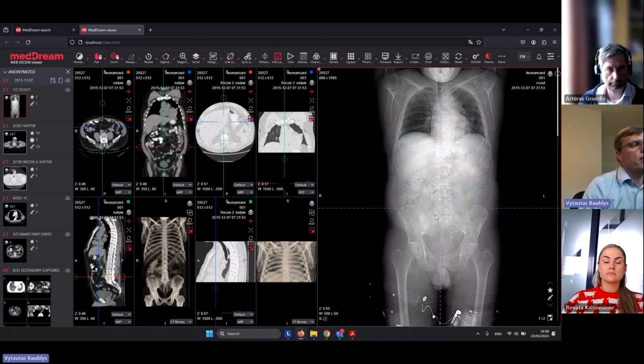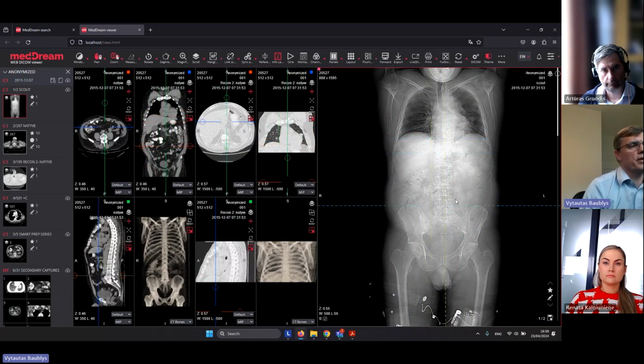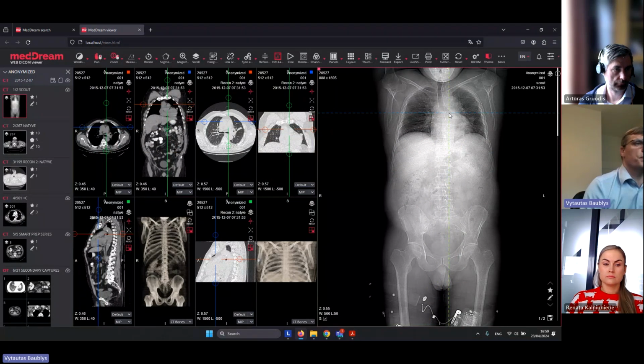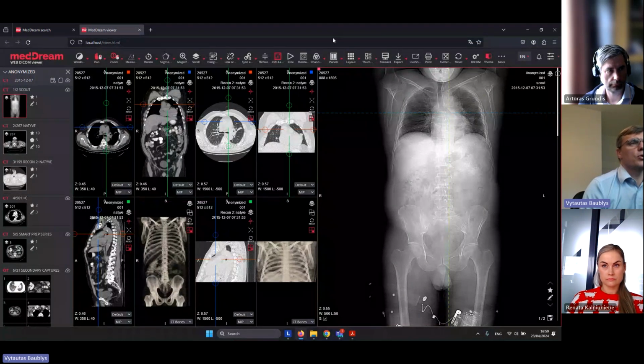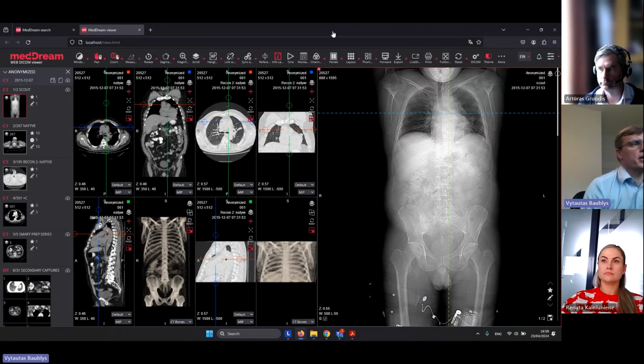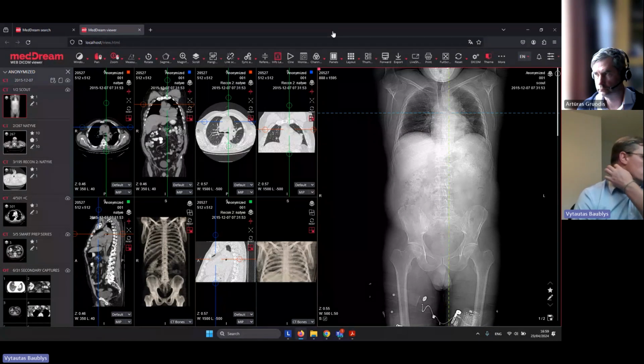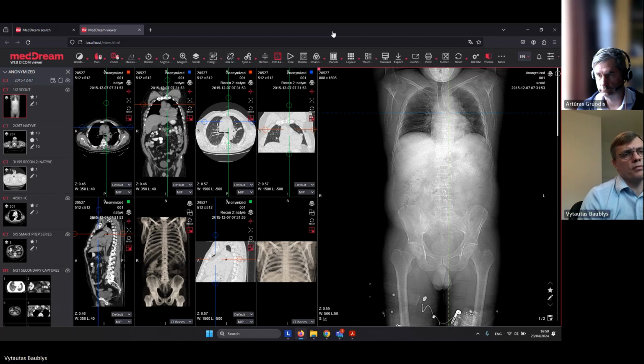It's possible, as you see. A little work is left to also make it possible to do the same between MPR views, but because we don't want to postpone this very important release, we limited some functionalities at this point, just to not stop the release for one month, because some features like hanging protocols are really in demand and awaited by our partners. But I hope in the very near future you will be able to propagate the crosshair even from the MPR view. For now, you can overcome it by putting aside an additional 2D image on which you can use the crosshair, and you can then move and align the MPR views.